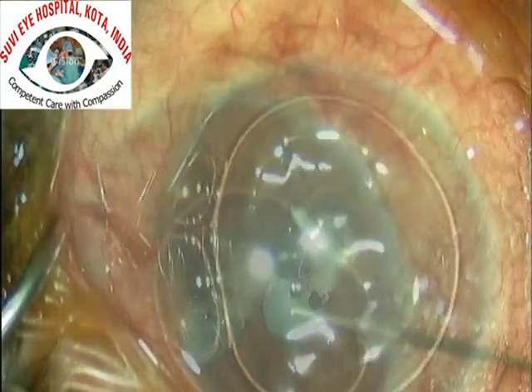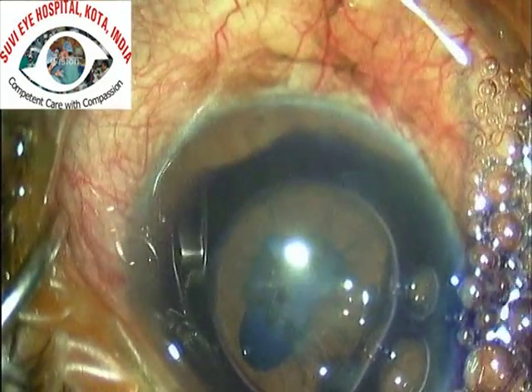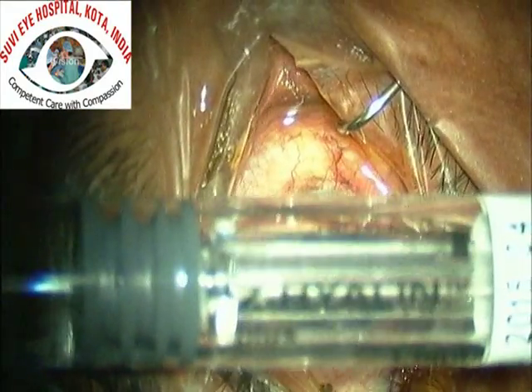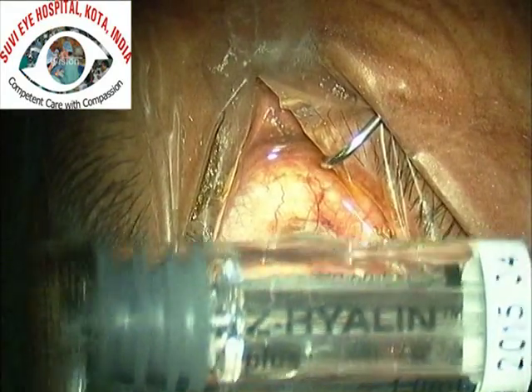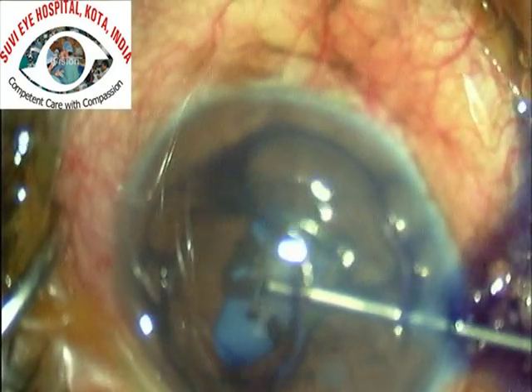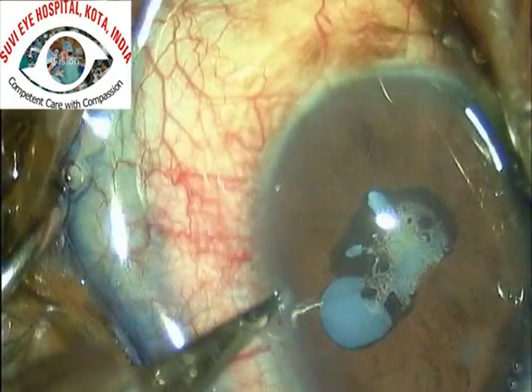Under an air bubble or with the soft shell technique, we stain the anterior capsule. It is also a good idea to use Viscoat or Z-Hyaline, which can protect the corneal endothelium well in the case of additional maneuvers needed in these surgeries.